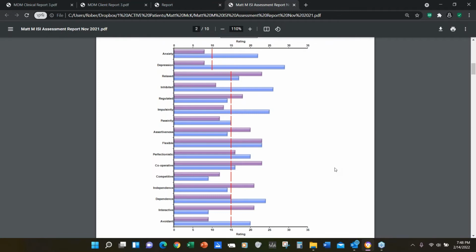Just because a person is under 18, there are people at the age of 16 who can report better than full-grown adults on what they're feeling. Yeah, that's true. So it depends on you as a clinician. Do I think this person can answer this well, and what do I want to get out of it? And am I using it responsibly, knowing that I'm going outside the normal parameters, like Rob said, but I get valuable information from it that's applicable. There's nothing wrong with that, as long as you own it and you acknowledge it.